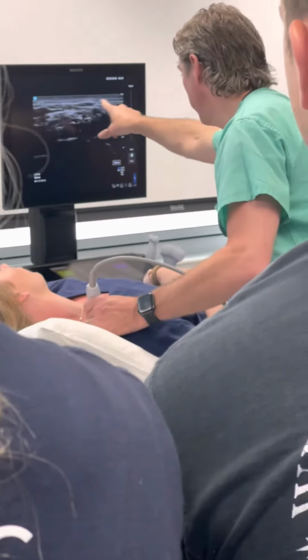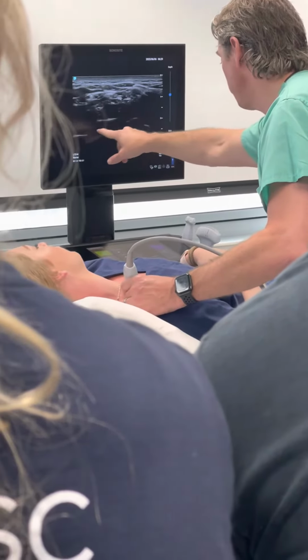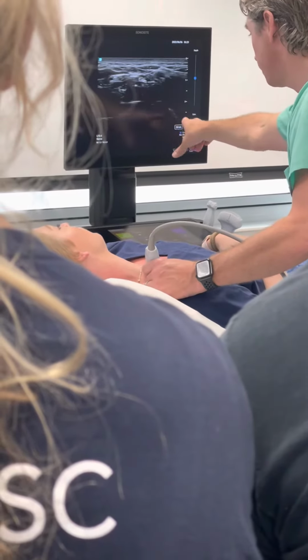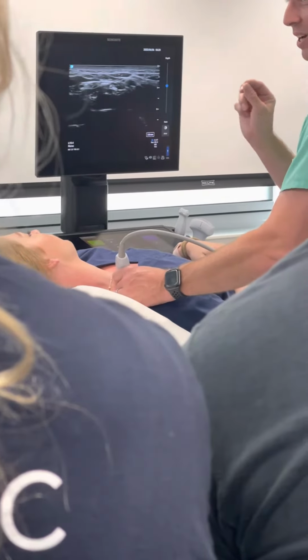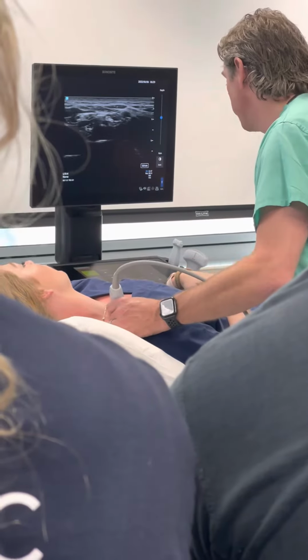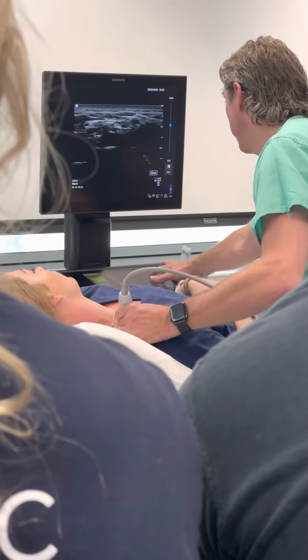You know, the sub-Q layer, all this kind of stuff, but down here it kind of gets fuzzy, right? And you're like, man, I really wish I could see these structures deep, because I know the lung is sitting down here somewhere, and it's something that I actively want to avoid sticking with the needle. So what we're gonna do is we're gonna tap that, and I'm gonna turn down my near field gain.